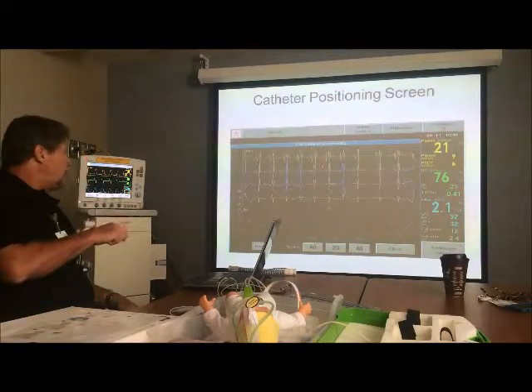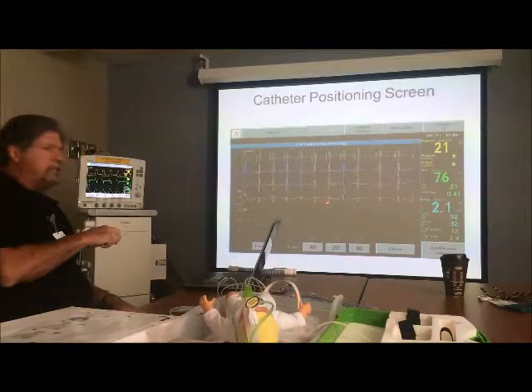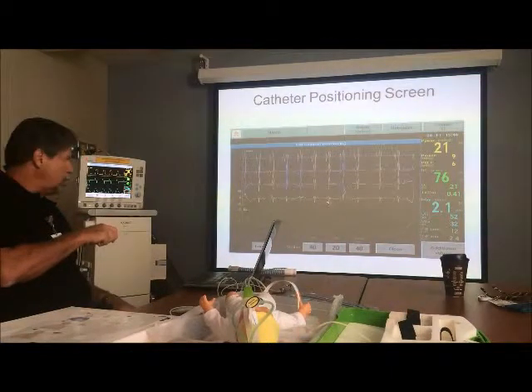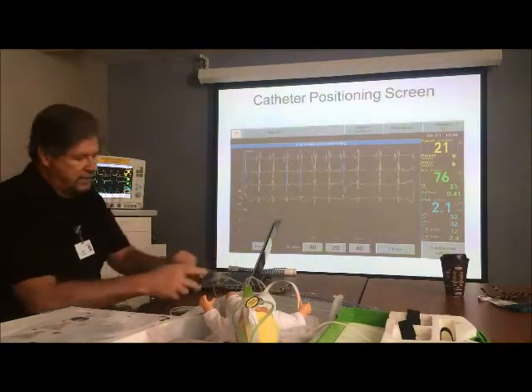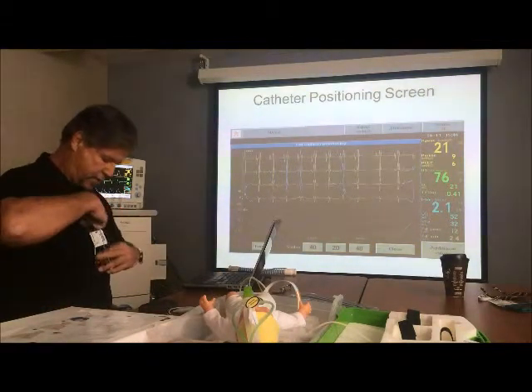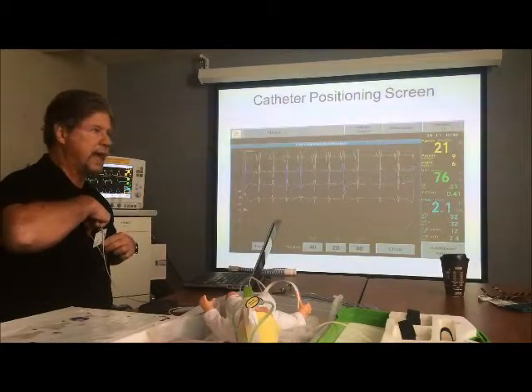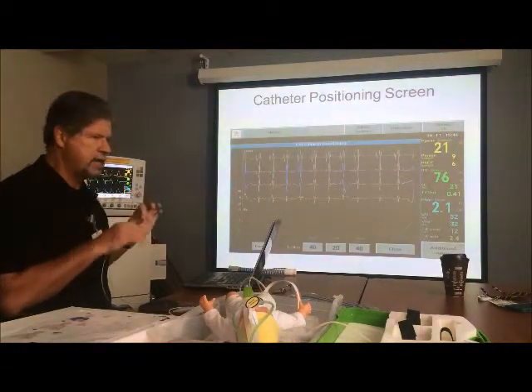So ideally we want to see a P wave actually disappear from top to bottom, that it goes away on the bottom. Another example could be that it curled up, so the QRS would be big up here and then smaller, and then big again because it comes back on itself. So that wouldn't be right either.